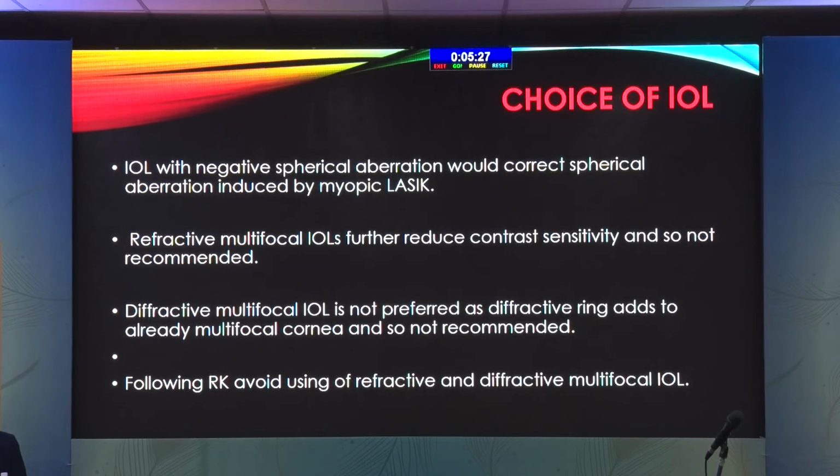And regarding the choice of IOL post penetrating keratoplasty or any LASIK, the IOL with negative spherical aberration would be correct for spherical aberration induced by a myopic LASIK. Refractive multifocal IOLs further reduce the contrast sensitivity and increase the spherical aberration and are not recommended. Diffractive multifocals are not preferred as diffractive rings add to an already multifocal cornea, so they are definitely not recommended. Following RK, always avoid using refractive and diffractive multifocal IOLs.